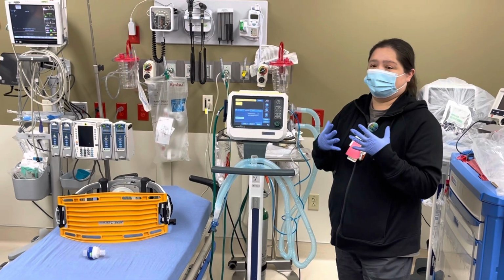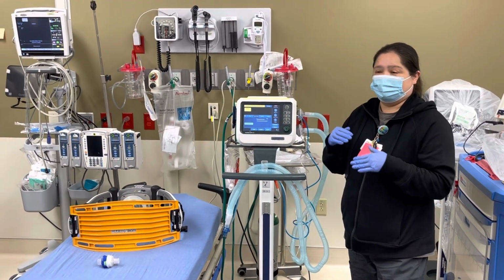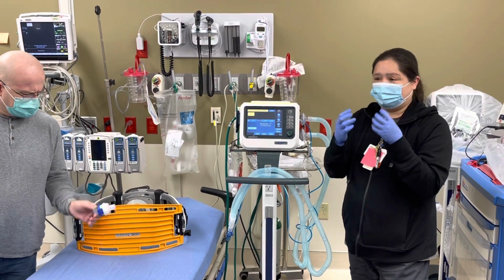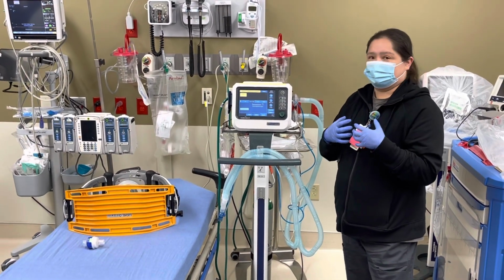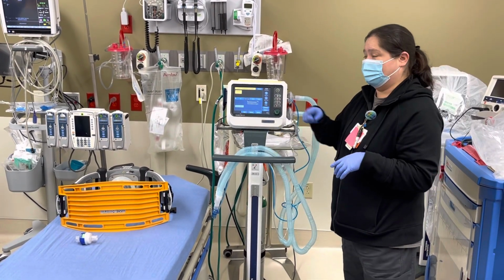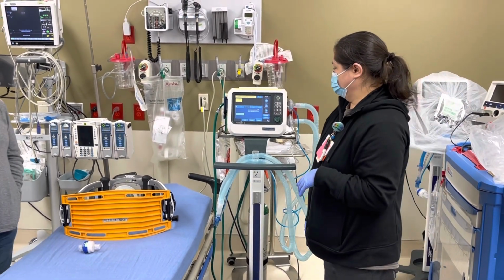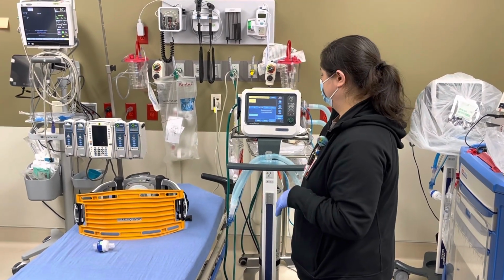It gives some type of moisture, because remember, oxygen's a dry gas. So after a while, that becomes very irritating, kind of like when people have a nasal cannula on and it's running for several days, they start to get nosebleeds and cracks. We don't want the same thing to happen inside the lungs. We don't want it to get irritated and dry. So that's why we always either keep an HME on or we'll put a heater on it. But to run the checks, you pull that off. Yeah, to run the check, pull it off.